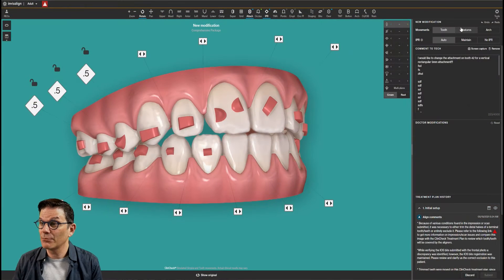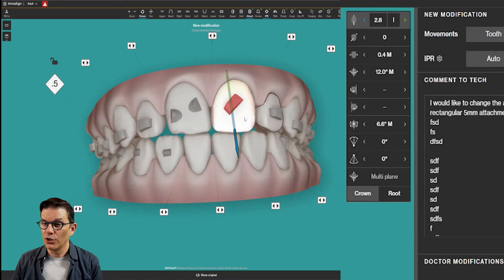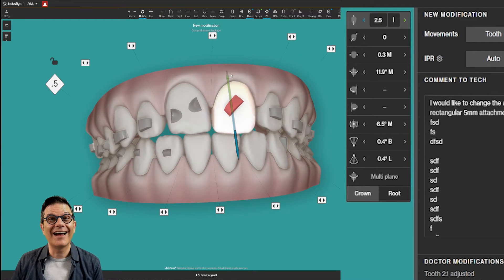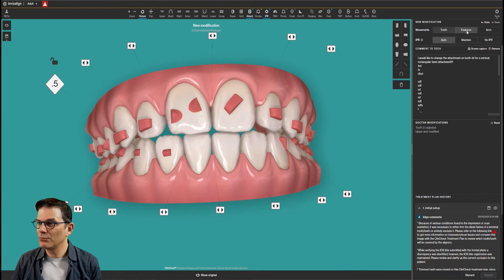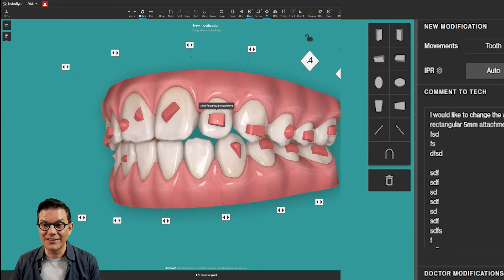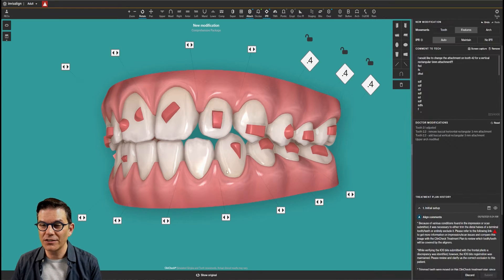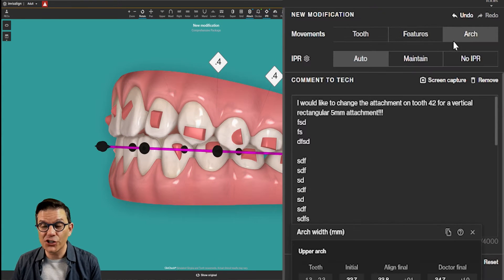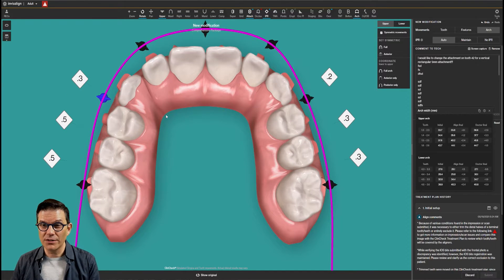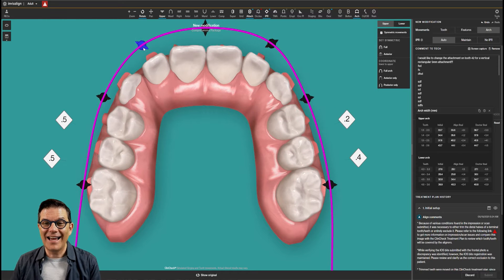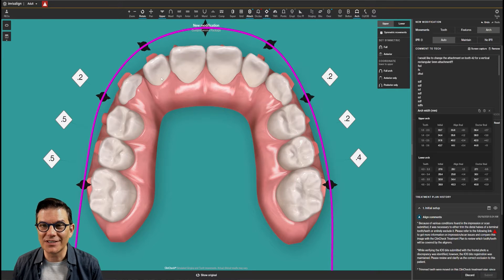What can you modify? Well, you can modify the teeth, the teeth position. So if I want to move this tooth like this, I can do it myself instead of writing it to the technicians. I can change the features — features are the attachments. I can remove them, I can add attachments if I want. I can change the arch, I can expand the arch, I can constrict the arch. I can do everything myself without writing everything to the technicians.